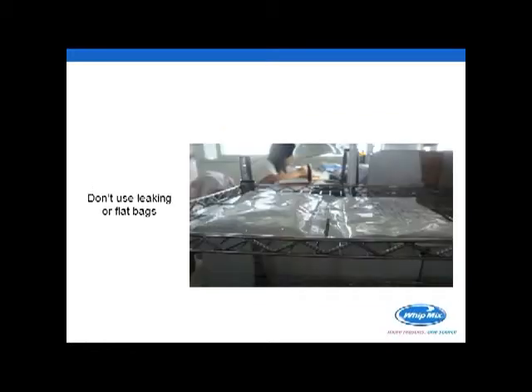Also, please don't use leaking or flat bags. These bags are not vacuum sealed. They do have nice seals on them, but they should appear like the bag on the left with a little bit of a pillow. You should be able to feel the air inside, and the powder material should move freely.